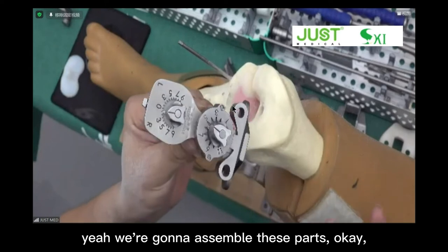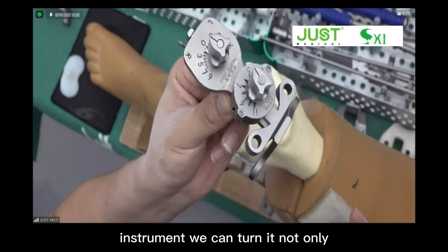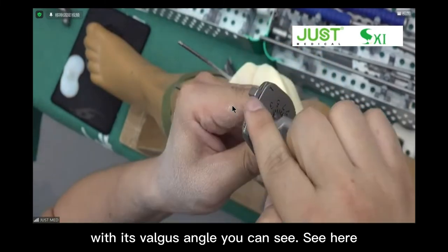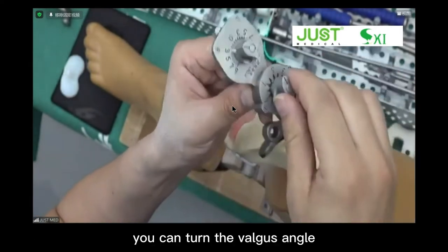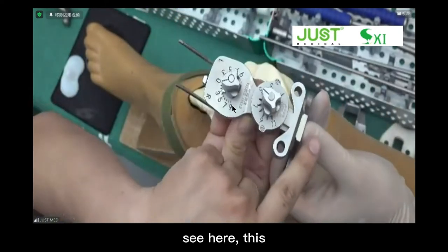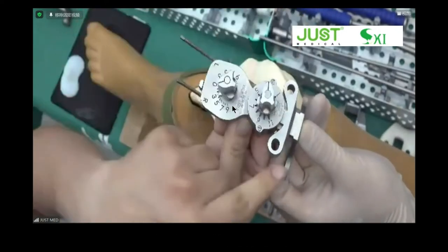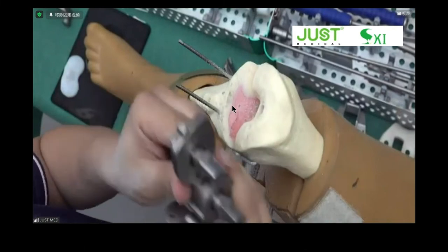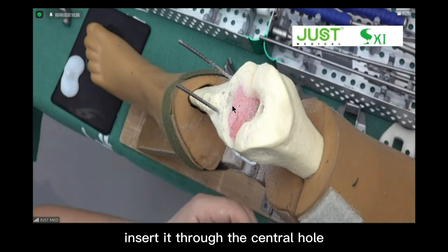We're going to assemble these parts. Before that, I would like to show you that we have this instrument. We can turn it not only with this valgus angle. You can see here. You can turn the valgus angle, and also you can turn the depth. See here, please. You can turn the depth. See? Here, it changes. Let's assemble the arm rod and this resection guide. Insert it through the central hole.